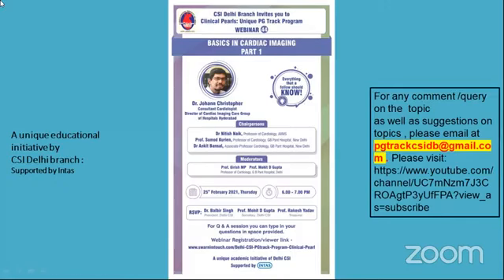Was that clear? Yeah. And as far as the assessment of valvular lesions is concerned, especially mitral stenosis with rheumatic heart disease being so common, in echo we have a very typical Wilkins score. So have we tried to devise any particular score for assessment of mitral valve disease, to show that MR is really contributing to the decisions whether these patients need to be intervened by percutaneous treatment or by surgical management of the valves?